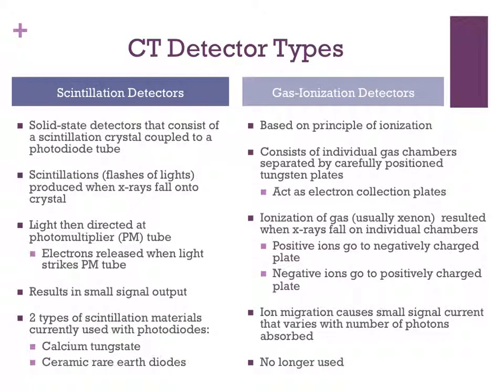Okay, very important. We will now discuss the CT detector types. There are 2 of them. First is the scintillation detector. This includes solid state detectors that consist of a scintillation crystal coupled to a photodiode tube.